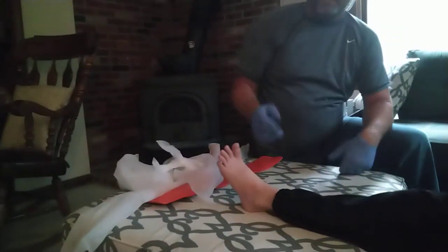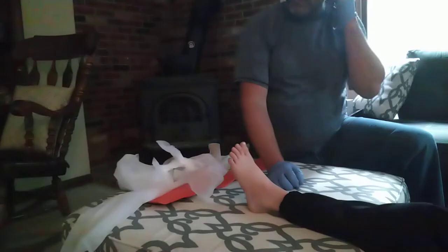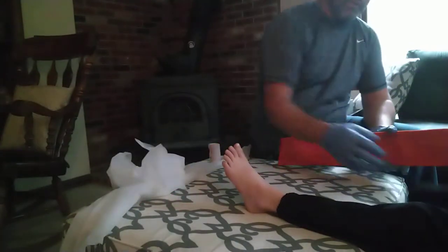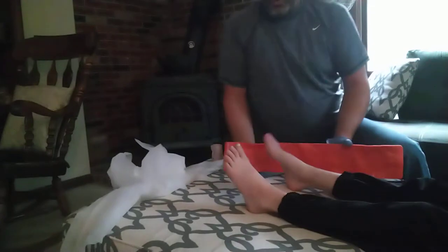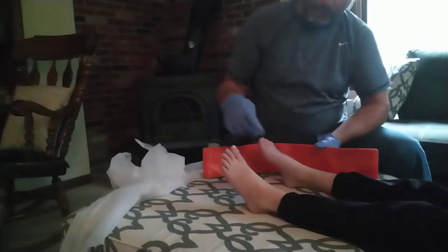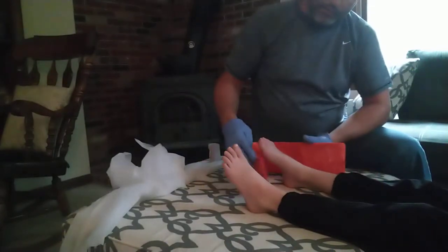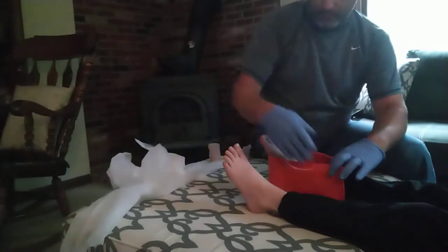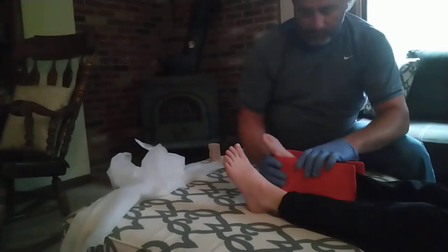Scene safe, BSI. Going to splint a sprained ankle. You're going to use the splint and measure on the non-hurt ankle. If they had a shoe on, you would first take the shoe off if you could. If not, you would splint it with the shoe on.